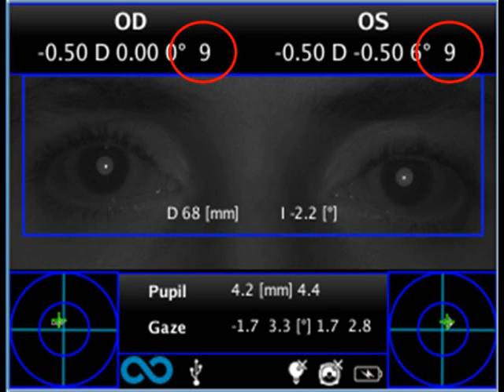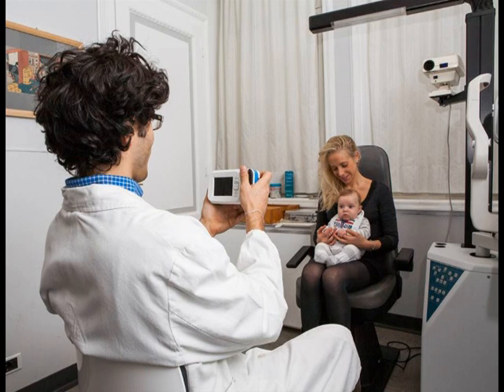Make sure the reliability index of the refraction measurement is higher than 5. In case of a reliability index of 5 or less, you will need to repeat the measurement.